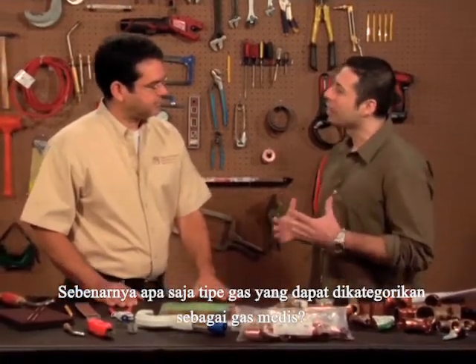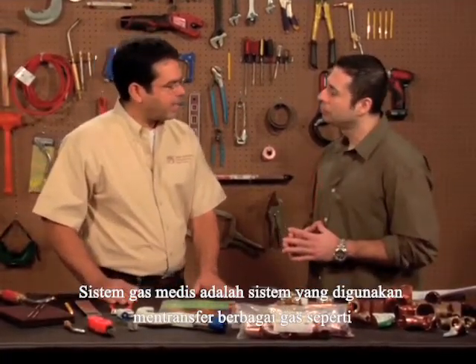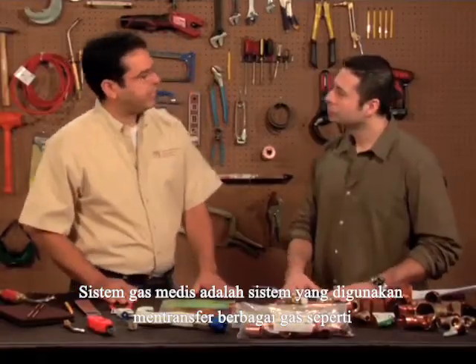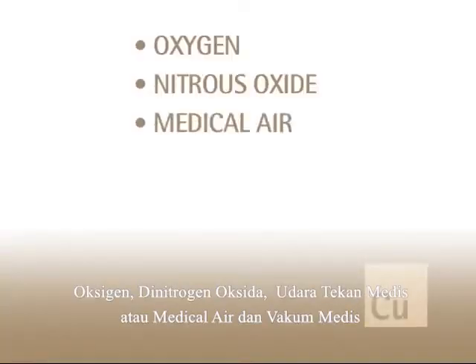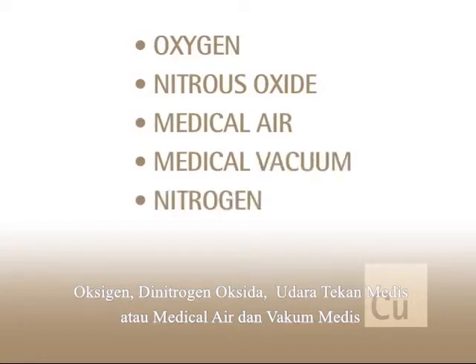What types of gases are considered medical? Medical gas systems are used to transfer gases such as oxygen, nitrous oxide, medical air, and medical vacuum.